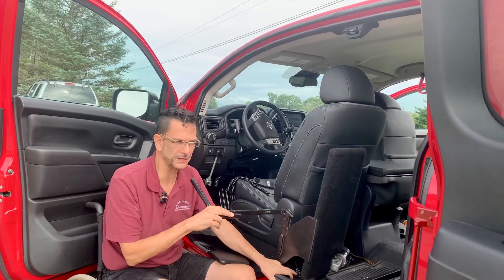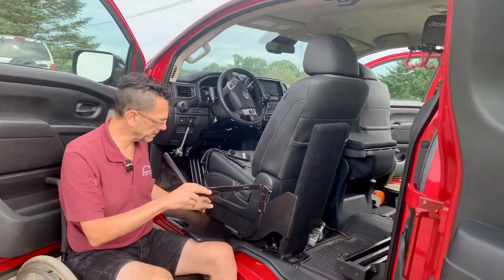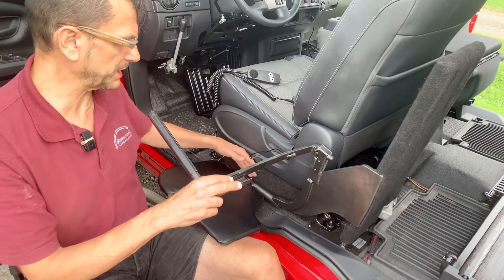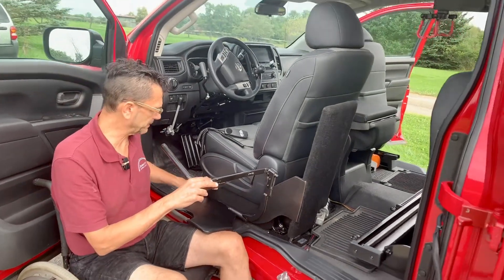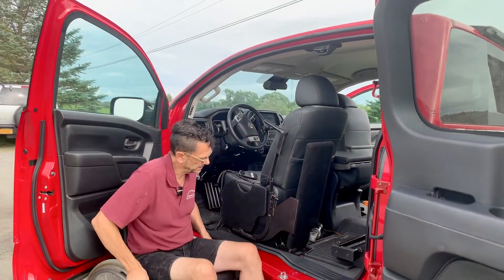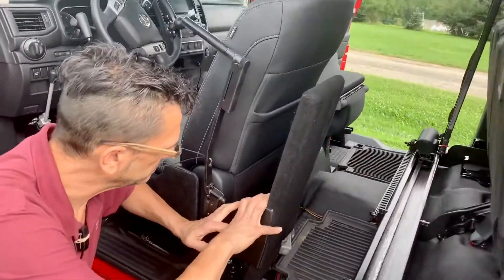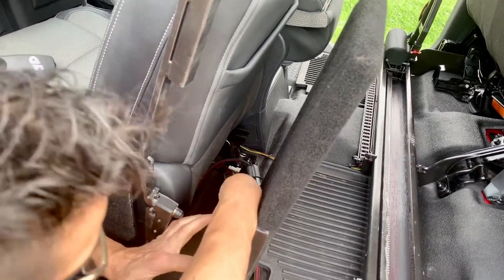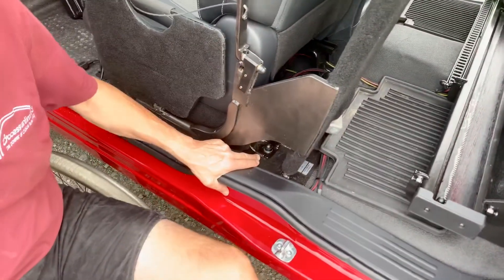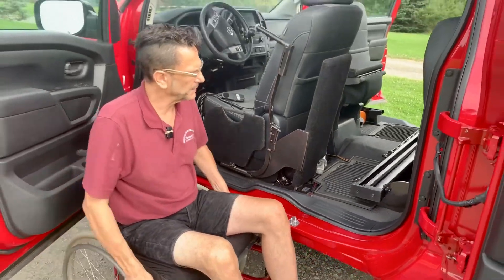These are going right into the OEM mounting hole locations, front and rear. On this particular one, there's also a special panel that Access Unlimited provides to give you a nice finished look down below on the bottom of the seat. You can see the back — that's where it mounts into the right rear seat bolt hole location. There's no drilling of holes in this vehicle, so you've got three mounts here that triangulate.